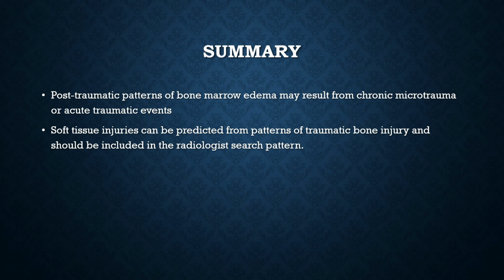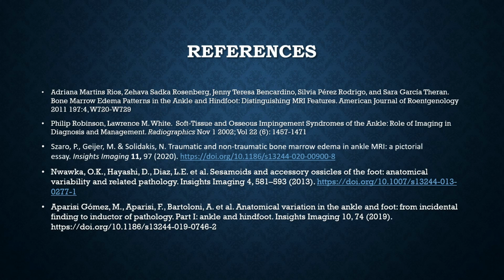So in summary, post-traumatic patterns of bone marrow edema may result from chronic microtrauma or acute traumatic events. And soft tissue injuries can be predicted from patterns of traumatic bone injury and should be included in the radiologist's search pattern. Thank you for your attention.